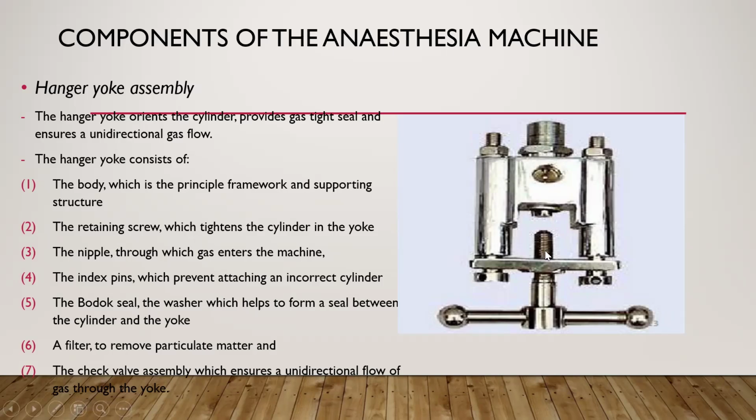The screw, this is the screw. The nipple, all right? The index pins. And each of them, don't forget the pin index system. We're going to come to that, all right? It has a pin so that you can only fit a specific gas cylinder to it.